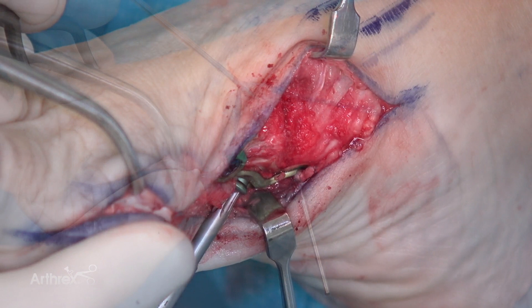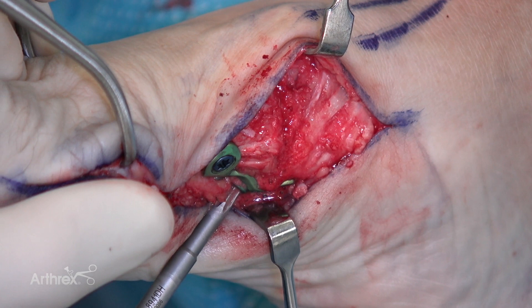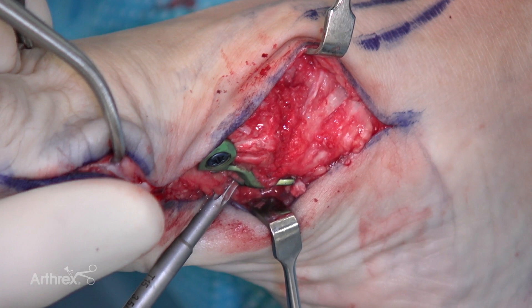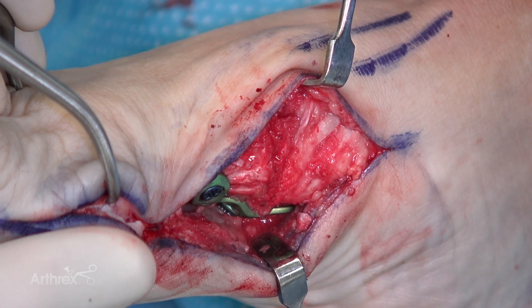Now we're ready to compress the joint. As the screw gets close to the plate itself, you'll start to see actual compression as this engages. I've got really good bite. You can see some of the bone marrow aspirate coming out as this compressed and the plate advanced a couple millimeters. So we've got good compression now built in through the plate on the plantar side of the joint.